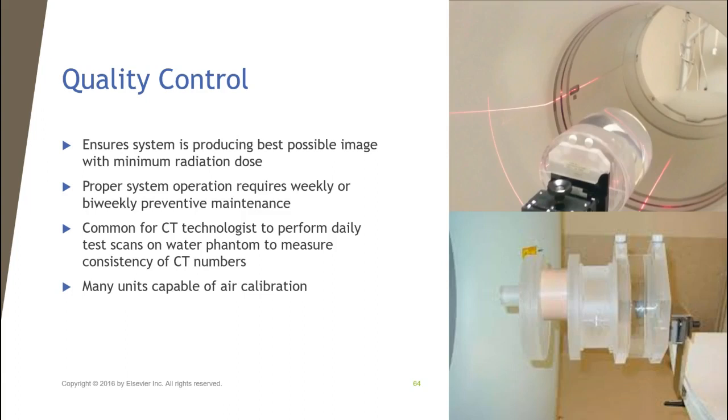Okay, quality control in CT. This ensures that you are taking the best possible pictures for your patients. So this is done usually on a daily basis. It's common for the CT tech to come in and the phantom is already set up by the tech who closed down the scanner the night before.